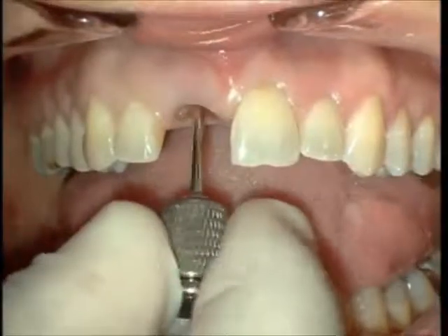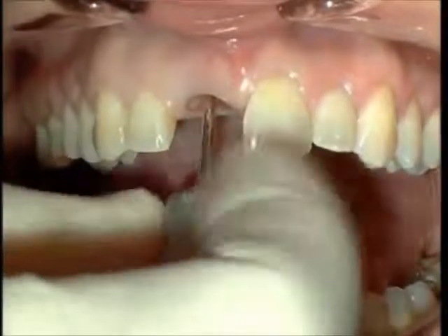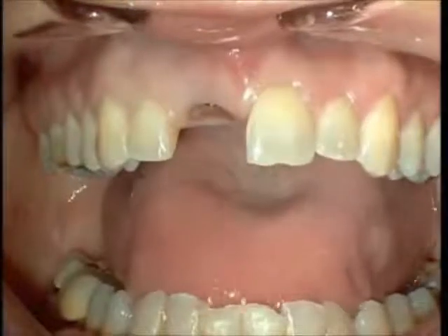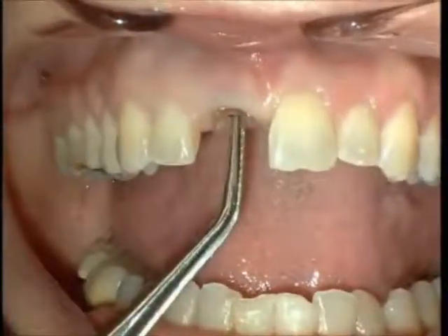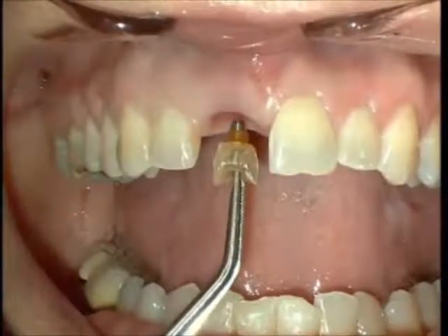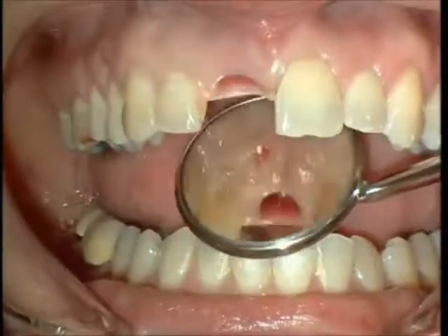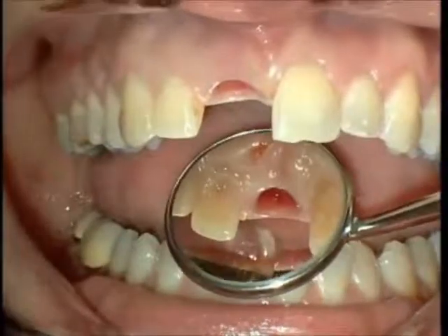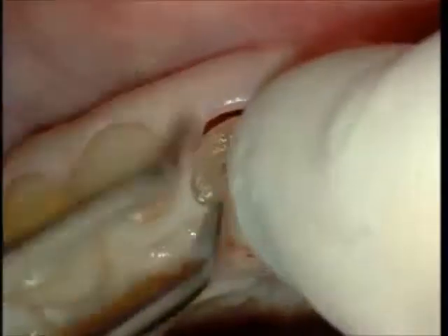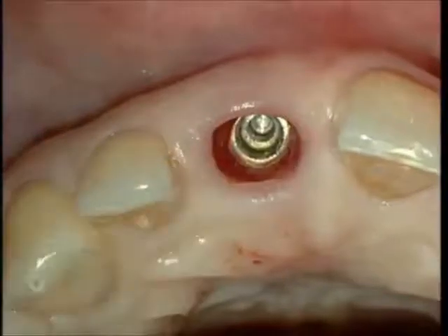This is 8 weeks post-op, basically taking you through what the restorative dentist would go through in a procedure like this. Unscrewing of the healing abutment, you can see how it's maintained the contours of the soft tissue, and you can see how it's shaped, flat contour on the labial and interproximal heights for support of the papilla. And here you're seeing just the soft tissue drape that has been maintained during the 8-week healing time. Look at the shape of this, how it's been maintained, and this is what we leave in the mouth and take out. You can see that that shape has been maintained quite nicely.